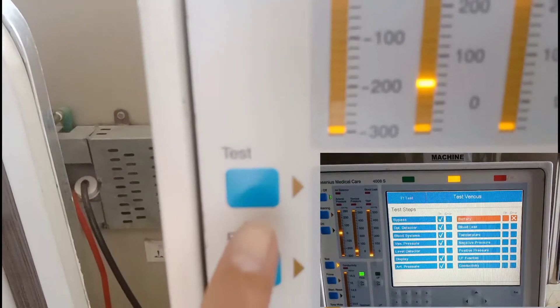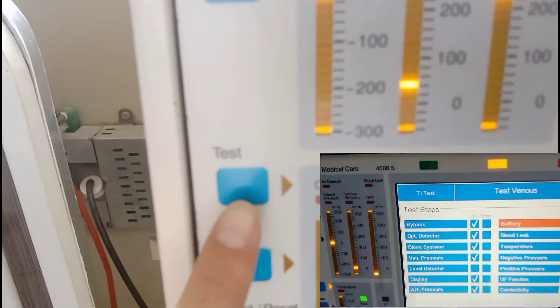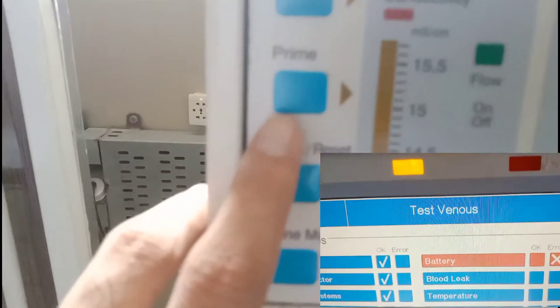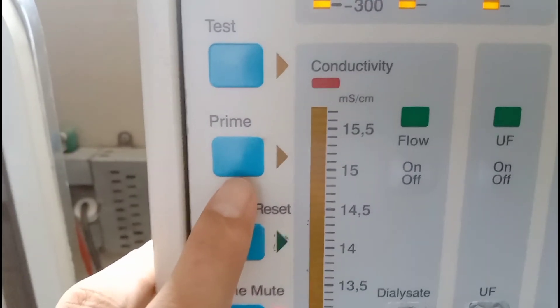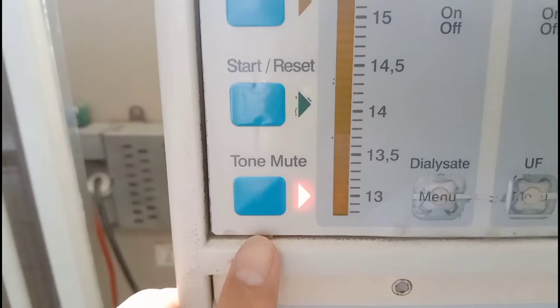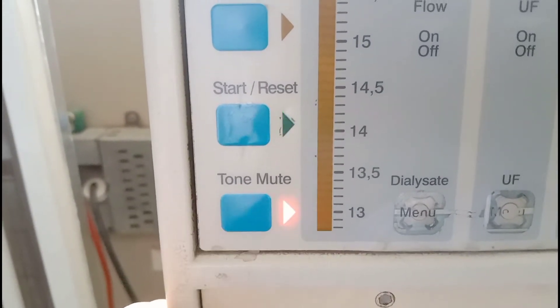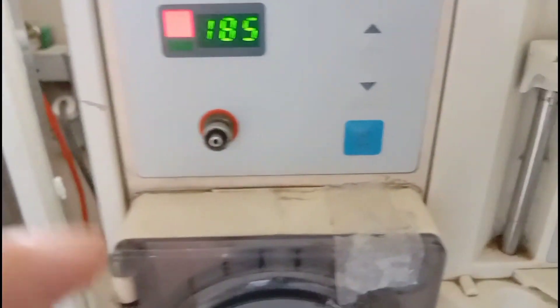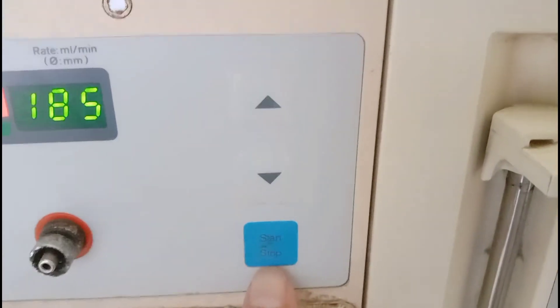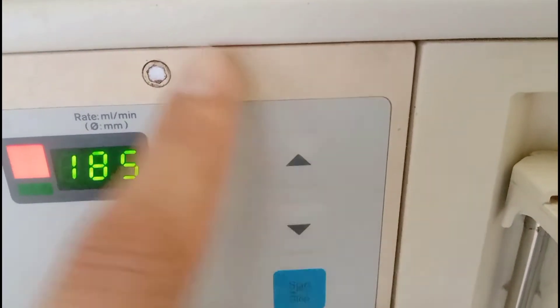Below the single needle button there is an option for test — you can put the hemodialysis machine on different tests, and these different tests are passed before operating the machine. Below this there is a button for prime; you can manually prime the machine by this button. Below here there is a start and reset button, then a mute button.